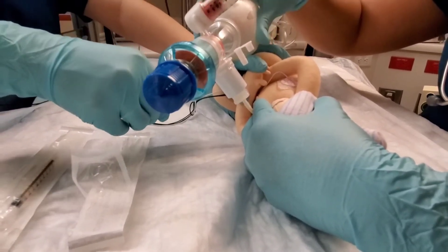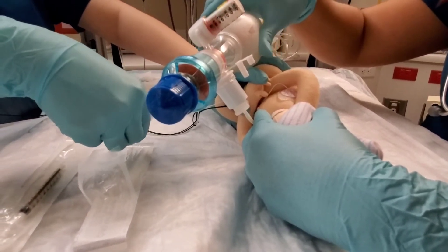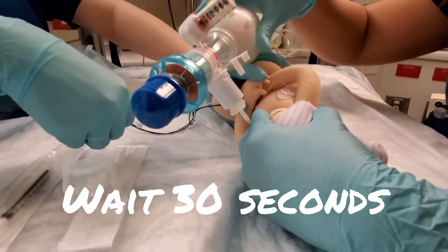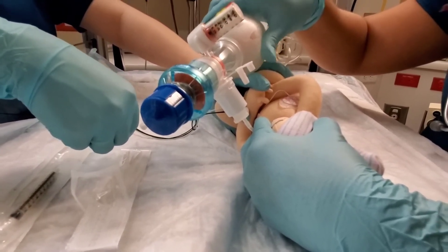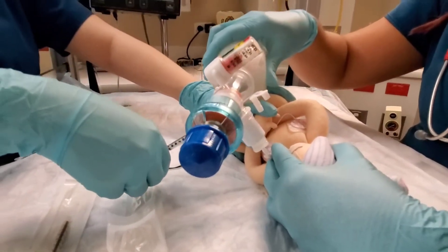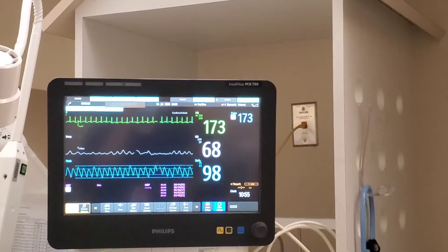After it's in, we'll actually wait 30 seconds with that same lung down. In this case, the left lung is down. So we'll wait 30 seconds to allow for good distribution. After 30 seconds, we will wind up turning the baby to the opposite lung. So right now we're just waiting, monitoring the heart rate and the sats. Everything looks good.